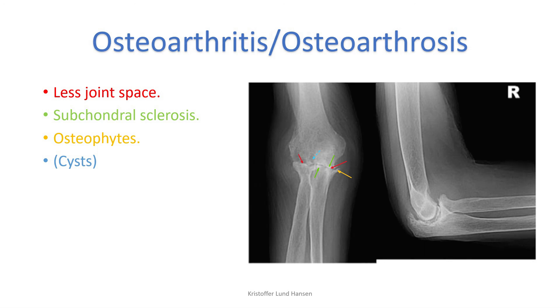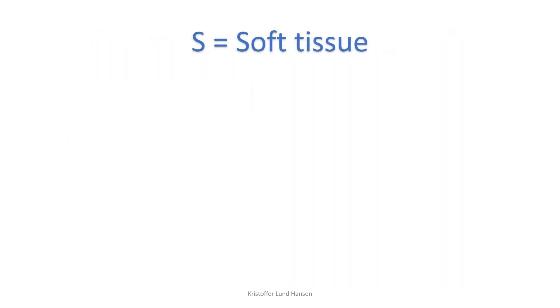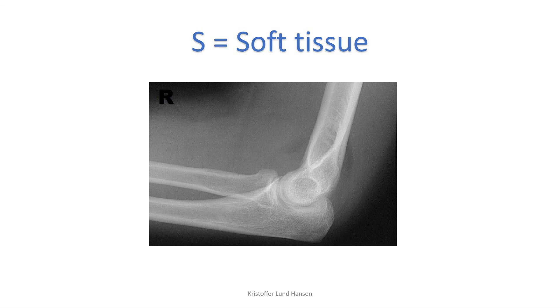The last point, S, stands for soft tissue. The main thing that we'll do here is to notice any swellings and effusions. There is especially one sign here that you should know of, called the sail sign. The sail sign suggests a fracture of one or more bones in the elbow area.